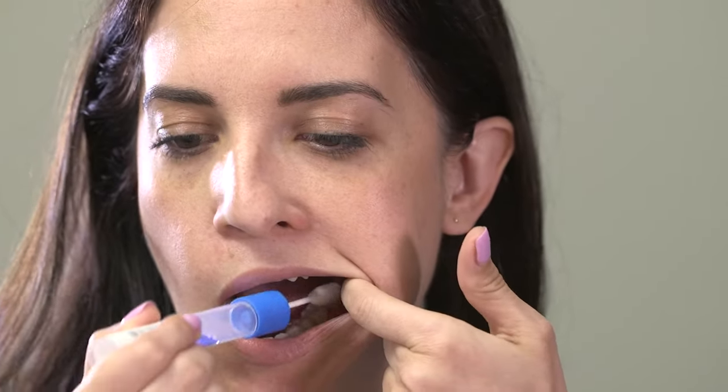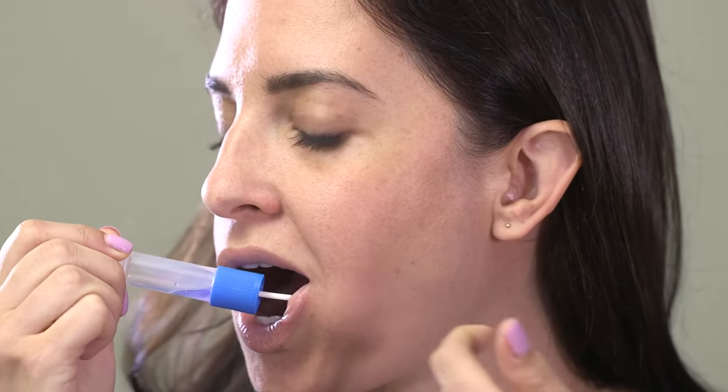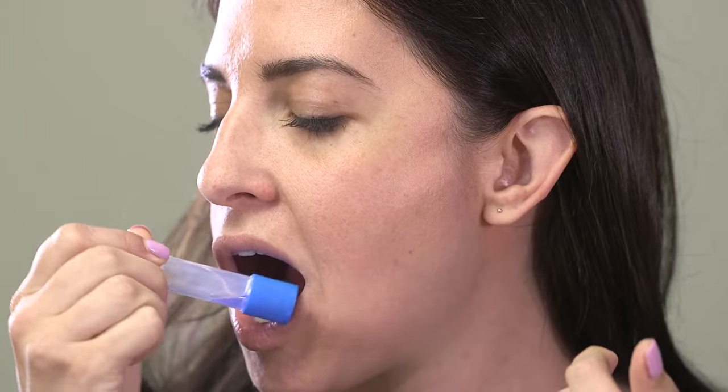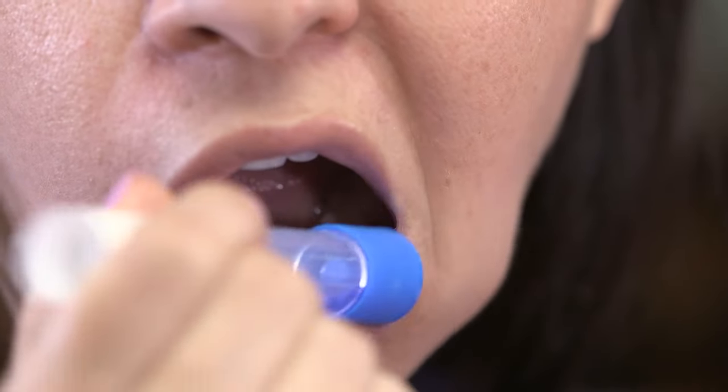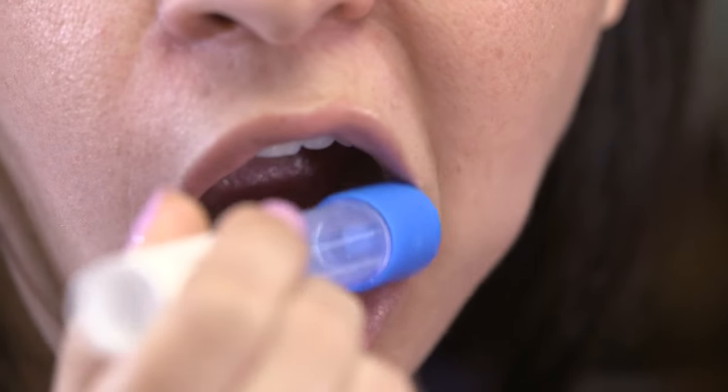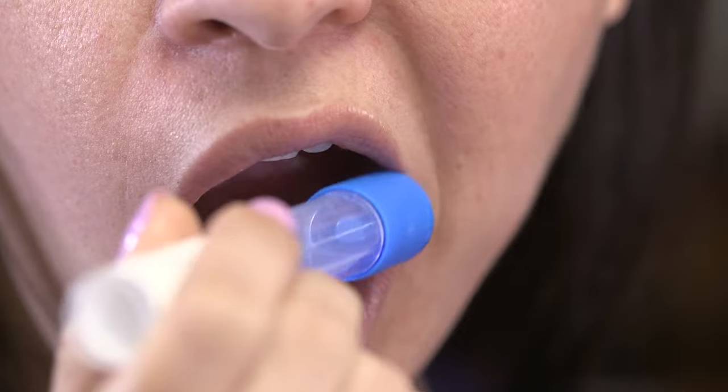Place the sponge on the left side of the mouth, on the inside of the cheek, in the space where the lower gums meet the cheek. Scrape along this area in a back and forth motion at least 10 times.